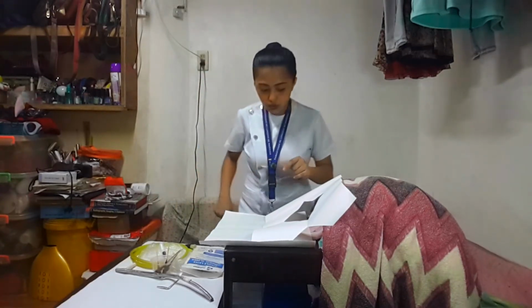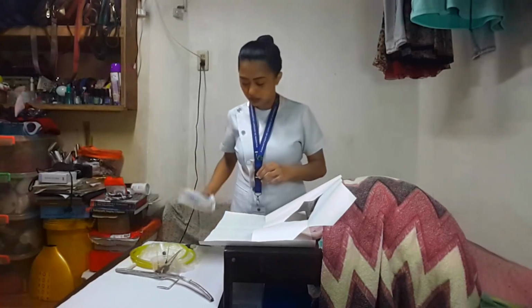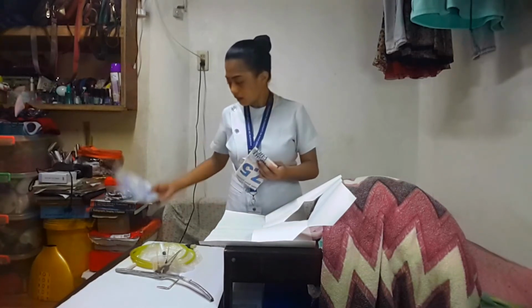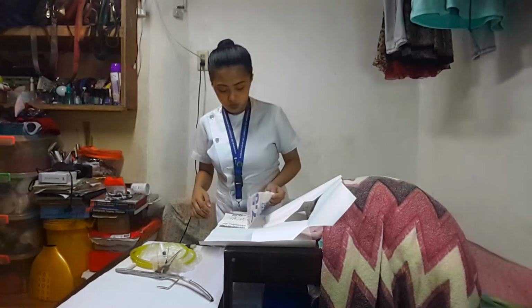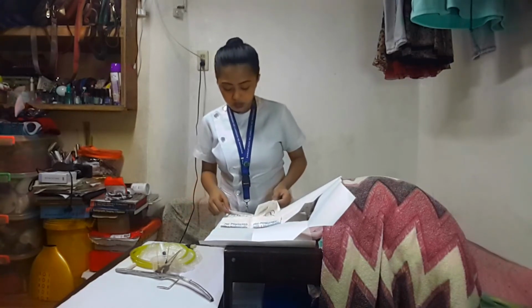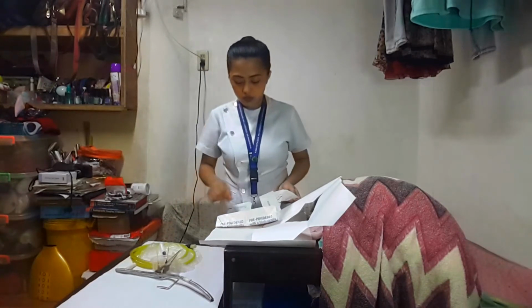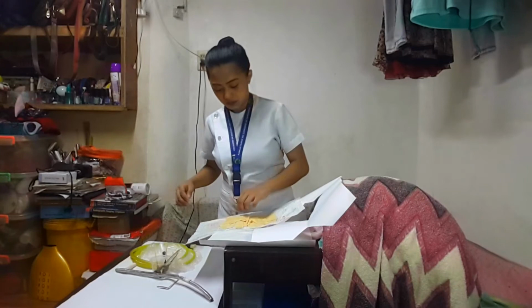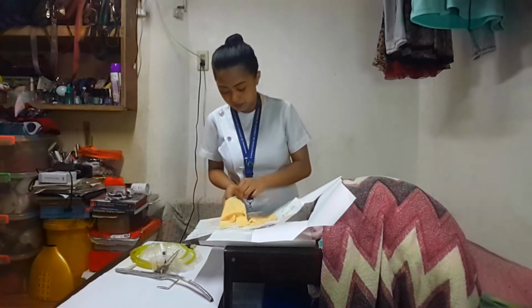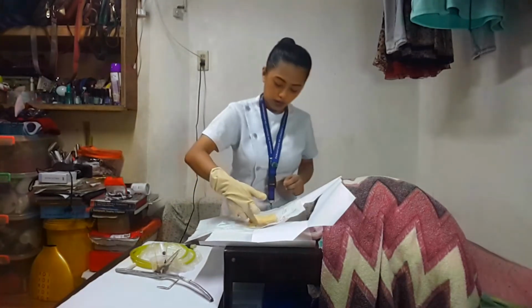Next is we need to wear our sterile gloves. Alright, so here are our sterile gloves. Since our space is not spacious, we need to do it here, but we have to make sure to maintain the sterility.